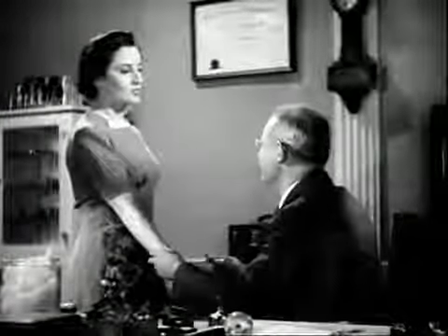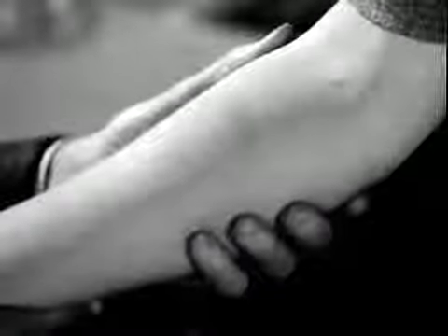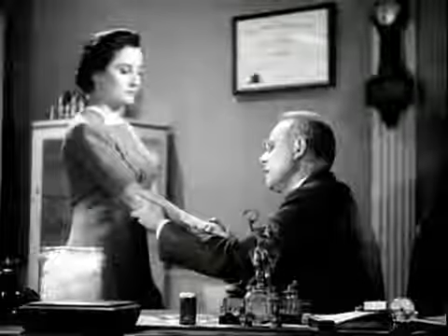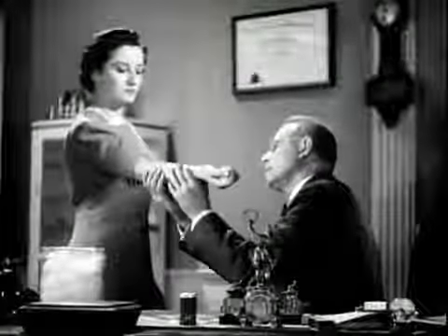Did it hurt? No, doctor, no more than a mosquito bite. The test is read in 48 hours. Hold the arm in a good light and flex a little at the elbow. Taut muscles may obliterate the reaction. Look across the arm rather than down on it.